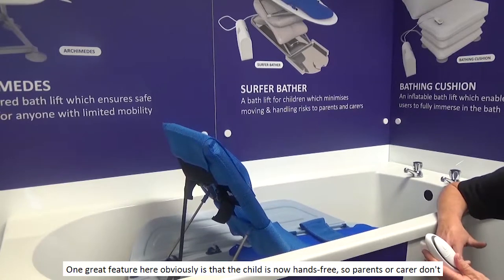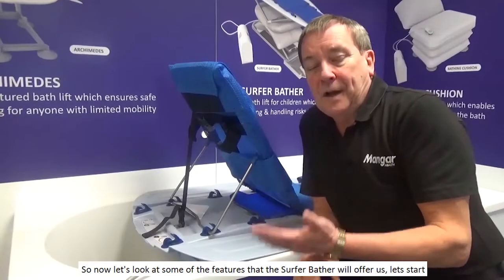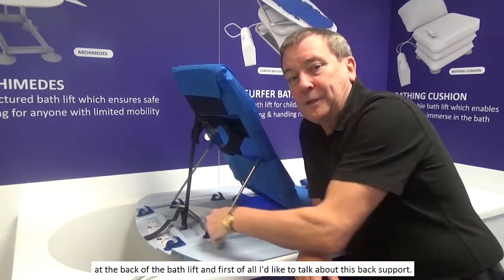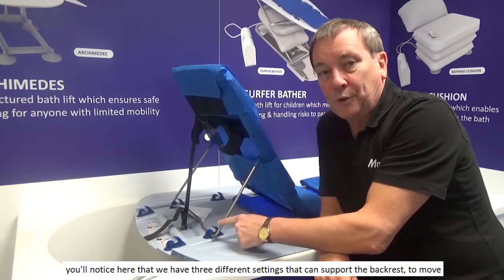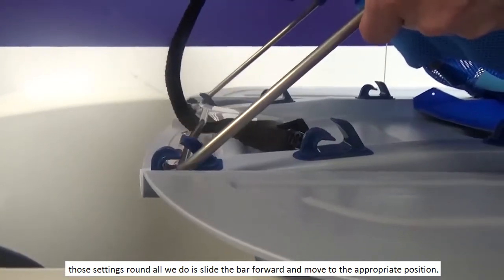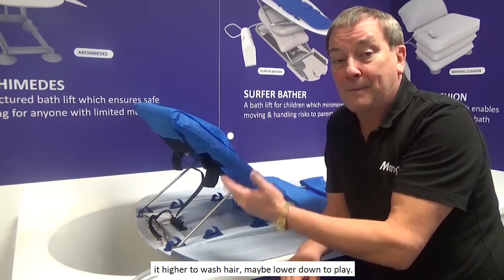One great feature here is that the child is now hands-free, so parents or carers don't have to hold on to the child while in the bath. Now let's look at some of the features that the Surfer Bather will offer us, starting at the back of the bath lift. I'd like to talk about this back support — you'll notice here that we have three different settings. To move those settings, all we do is just slide the bar forward and move to the appropriate position. This gives the child four different settings for enjoying the bath — maybe one higher to wash hair, maybe lower down to play.